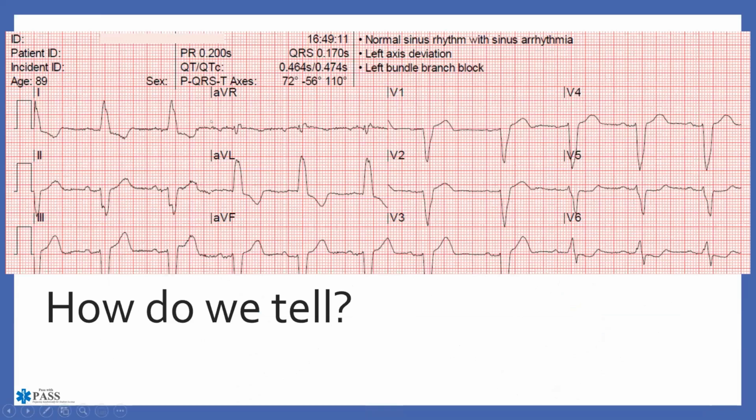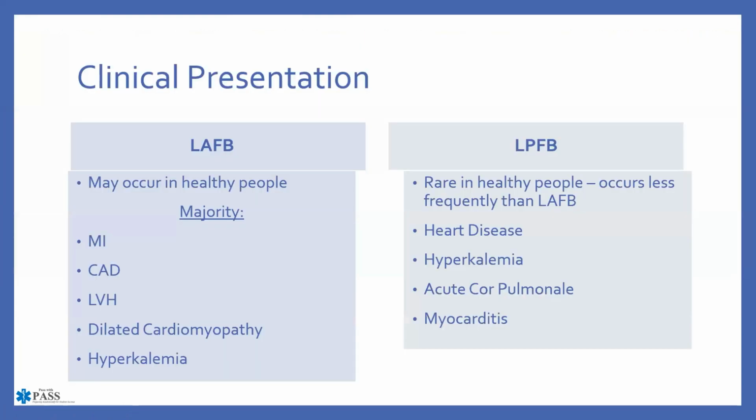So how do we tell? I already have kind of answered this a couple different times, but if you look at the QRS in this situation, remember I told you the number is less than 0.12 or 120 milliseconds. This one is obviously way over that. It's 170. Or you can simply look in your lead V1. I find my lead V1, it's clearly too wide. I end up finding my J point. I back up 0.04. It's a negative deflection. And look here, it is a left bundle branch block. So in this situation, what we're going to end up having to do is either call in and say they're having a STEMI, or apply the Sgarbossa's criteria to it.